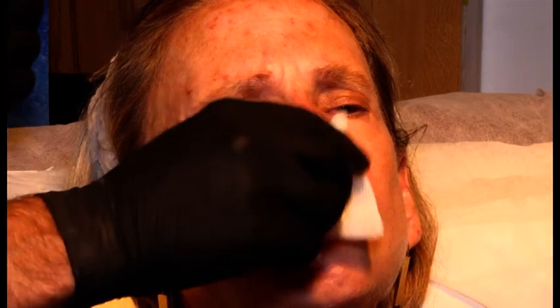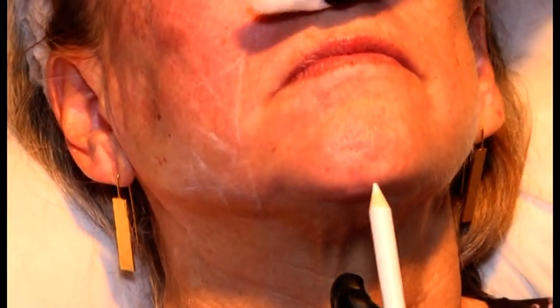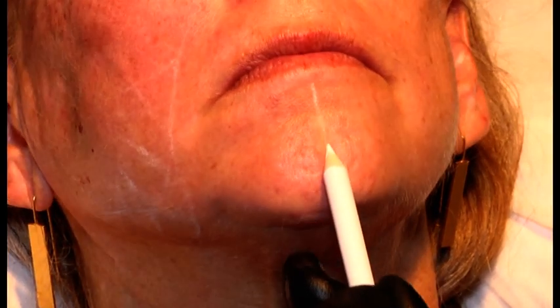All right, so for chin augmentation, you can have different approaches. We're going to zoom down to the chin. This is the midline.